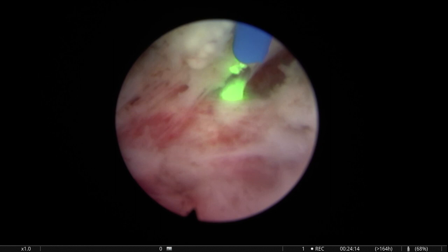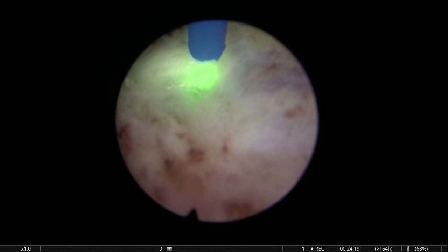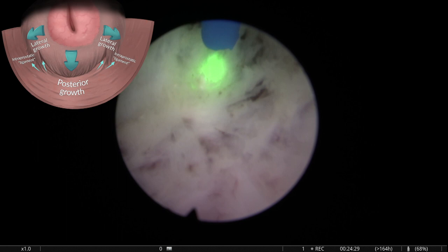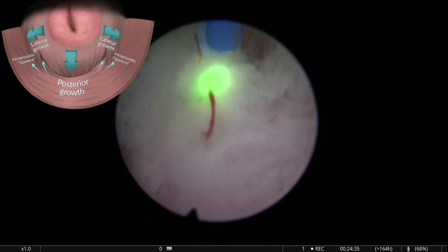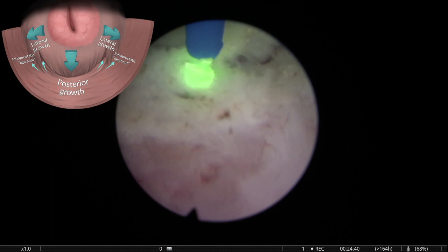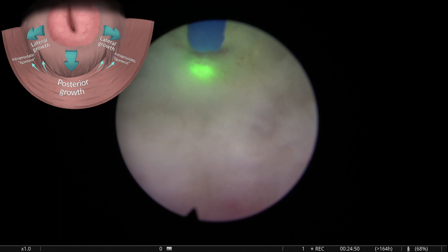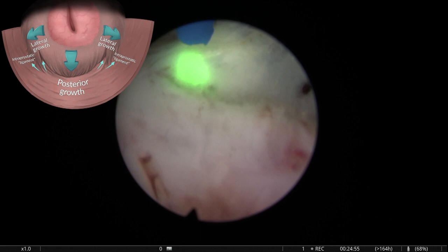You see, sometimes the bump of the middle lobe towards the posterior aspect makes a depression there, and it is confusing. I have thought about this a lot. The middle lobe is pushing down, and it makes a depression on the capsule. But the lateral lobe is pushing lateral. So many times when you go from the posterior middle lobe to the posterior lateral lobe, you see there is a change of plane.